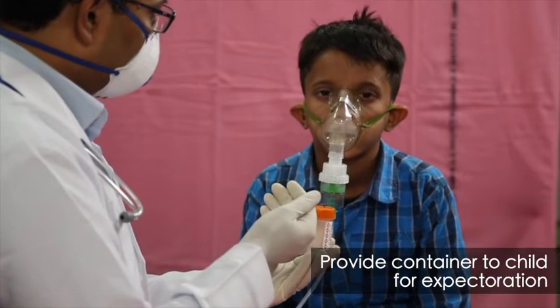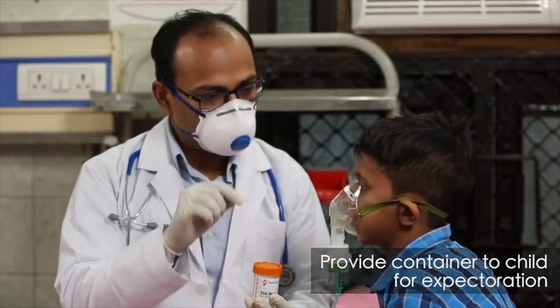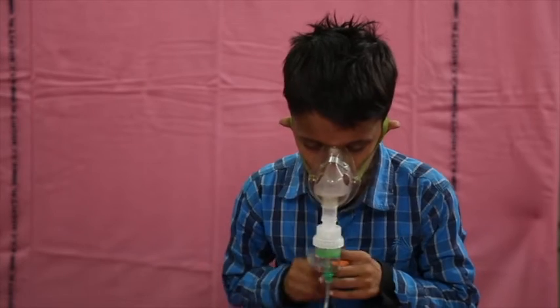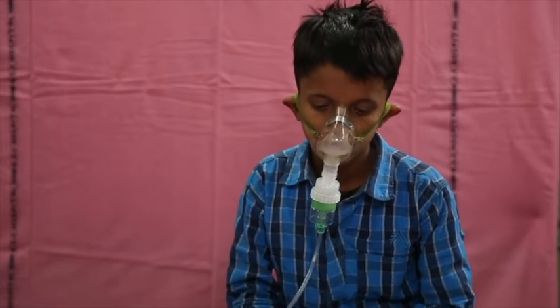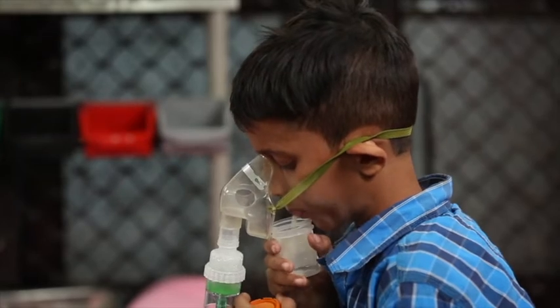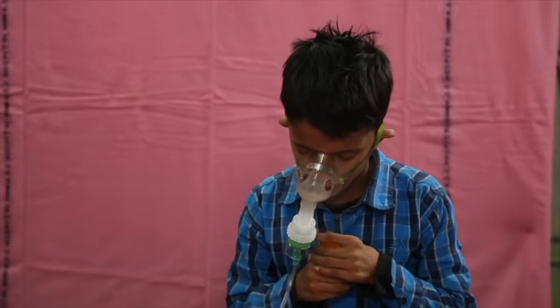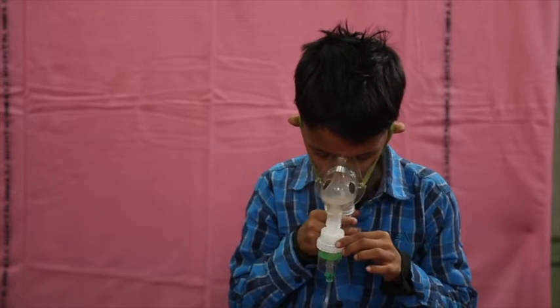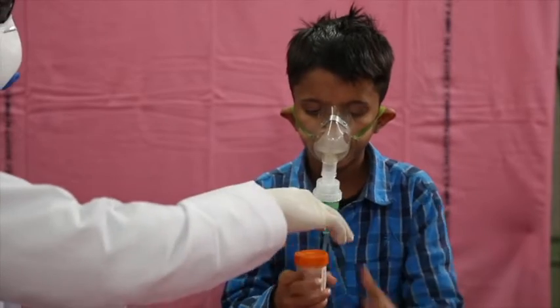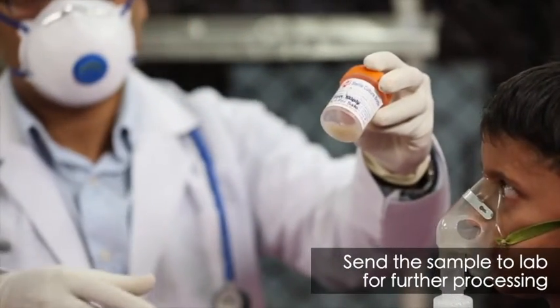While the child is being nebulized, give a container to the child to collect any expectorated sputum. As evident in this demonstration, the child has started expectorating while being nebulized with 3% saline. If the sample is adequate, the procedure may be concluded here and the expectoration sent to the lab for further processing.